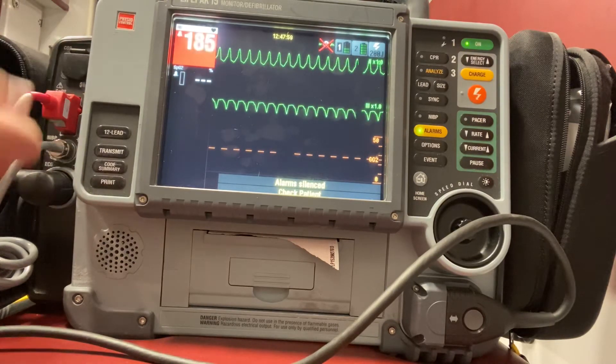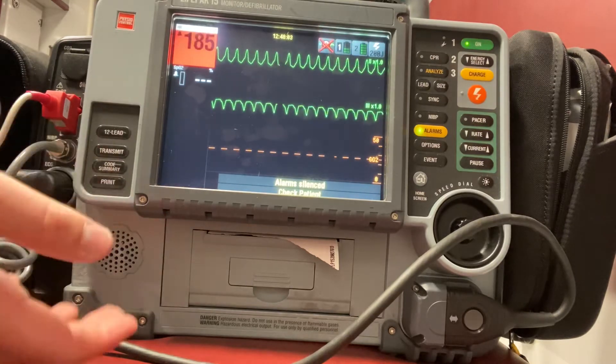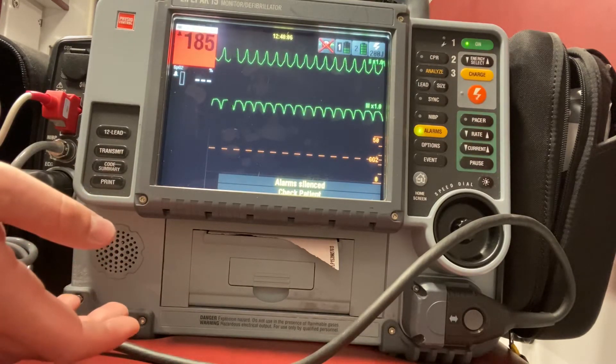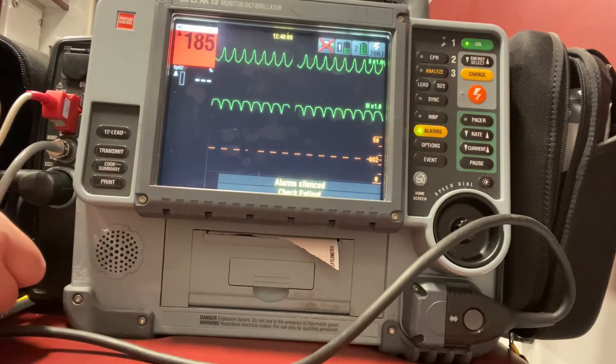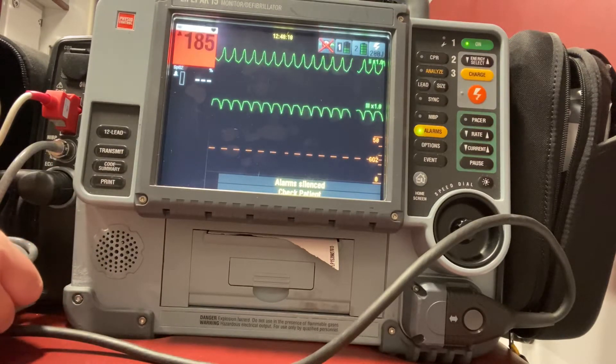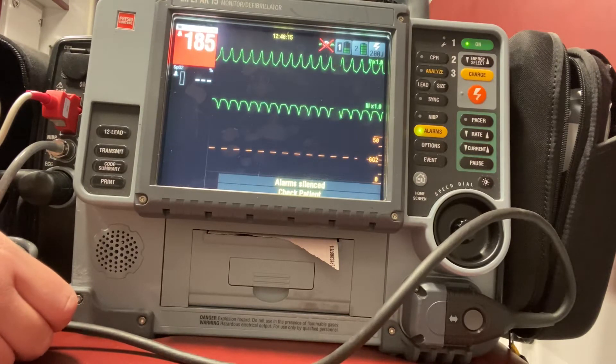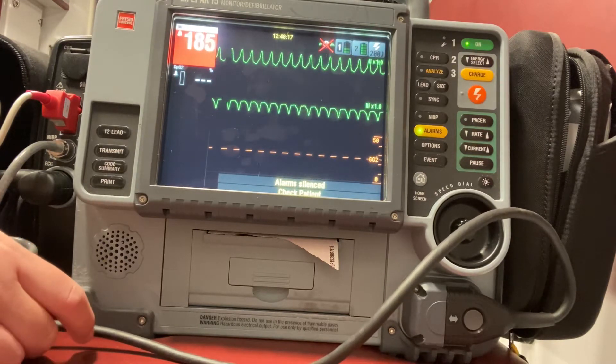I have a patient here who's in VTAC, I've deemed them unstable, and I've decided to go ahead and synchronized cardiovert. For VTAC, my doses of energy for cardioversion start at 100 joules, going up in increases of 100. So my next one will be 200, my third will be 300, and then my last shock would be 360.